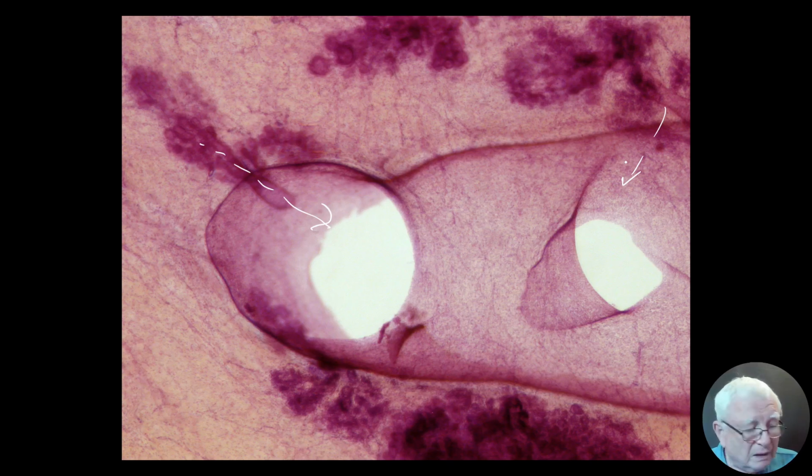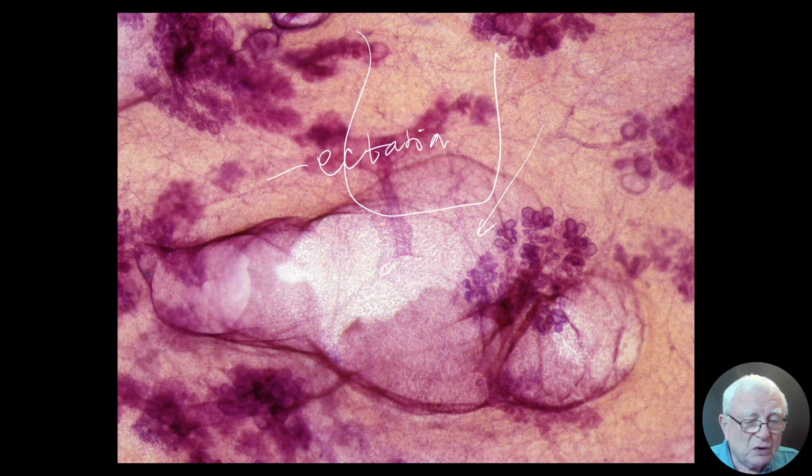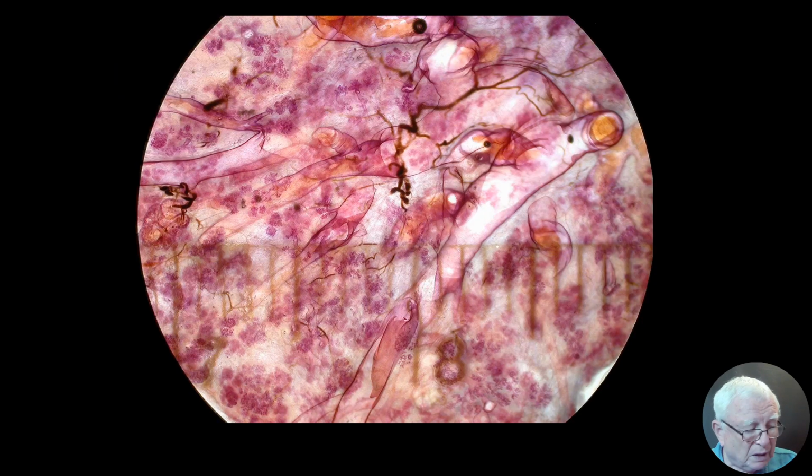Sometimes it's called milk. Sometimes it's called cyst fluid. Or it's not even a cyst yet, so we call it duct ectasia. I just put an ultrasound over it. Of course you are going to see the fluid on ultrasound. And your and my job is going to be to answer the question, what produces the fluid?